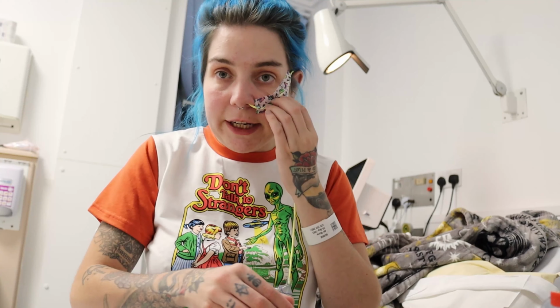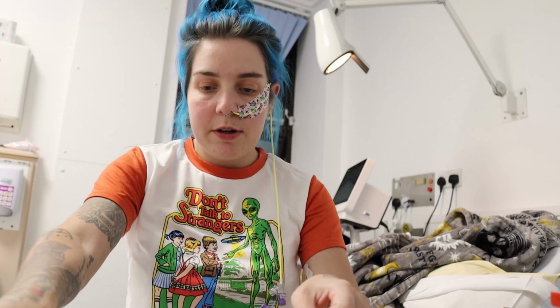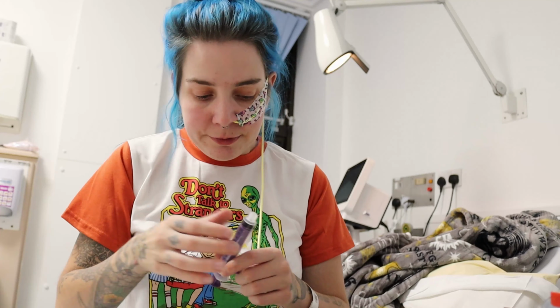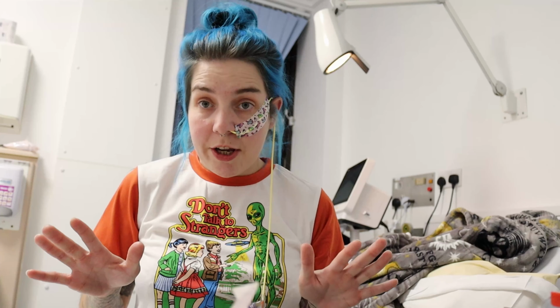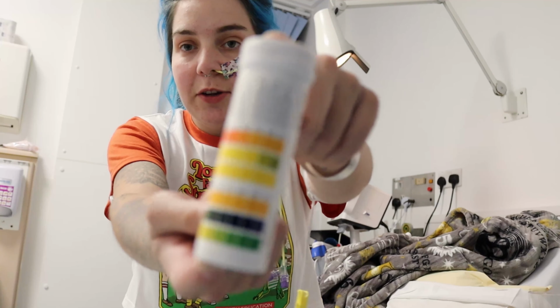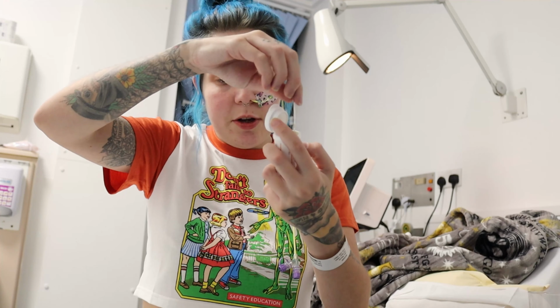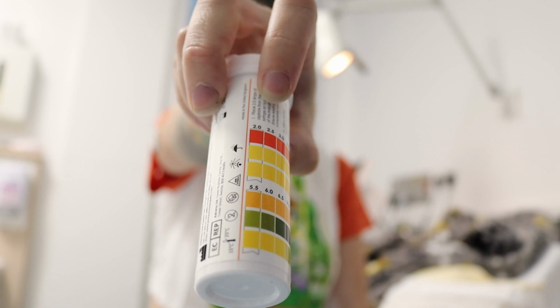It's really irritating when I can feel it kind of coming out my nose. So now we want to do a pH level, and I haven't had much to drink in the last hour, so down the hatch. See if we can get a bit of aspiration. Didn't want to show you what was in the rest of that syringe, but we are definitely in the right place. If I didn't definitely know it's in the right place, I would use pH strips, which look like this. And then you want it to be between 2 and 5. So if it's in the green, bad. If it's in the red, fine.